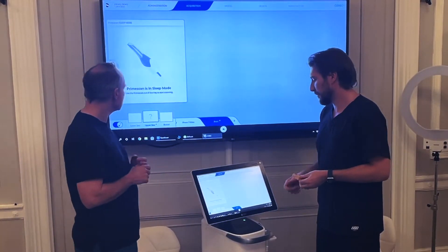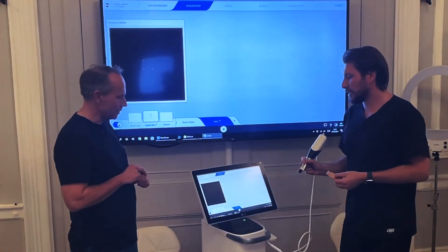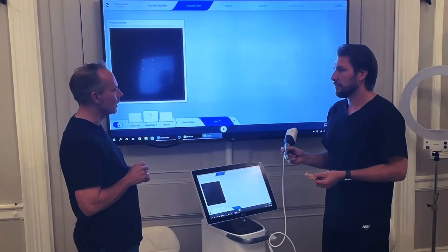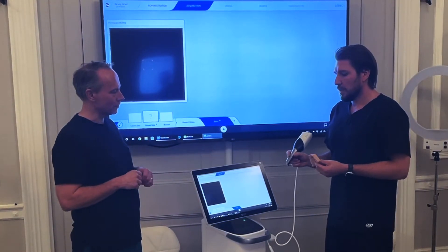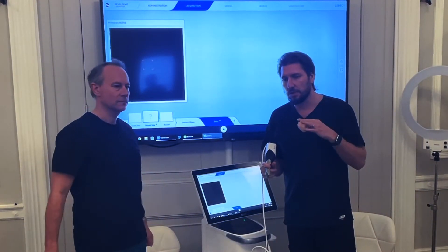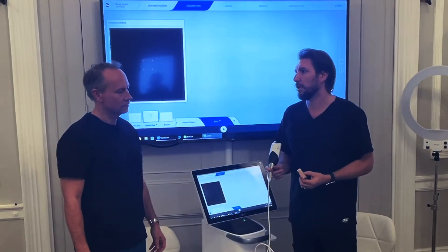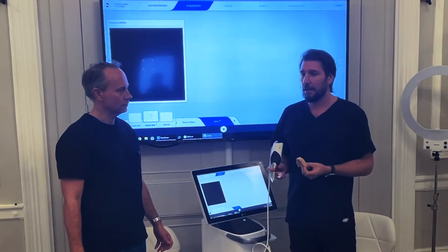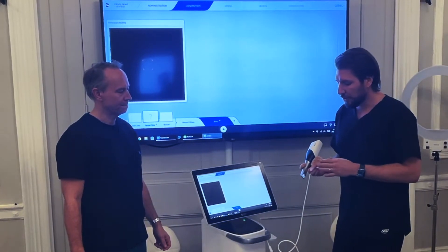So we found the approach and found the camera. With the latest 5.2.2 update it starts in white and then goes blue when you start scanning, so it doesn't blind you quite as much. You've covered the actual scan method previously in training, so the key thing when going over a full arch scan is to be methodical.